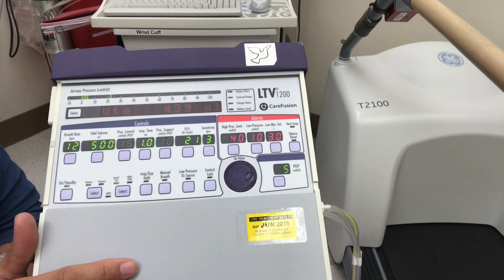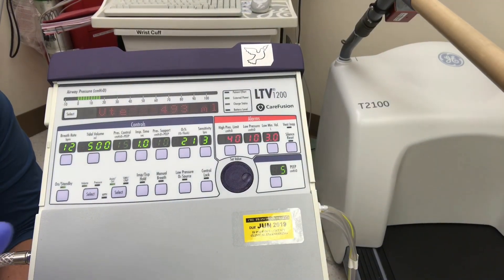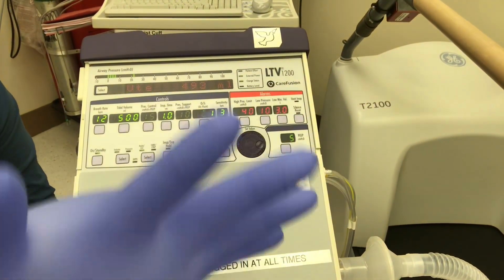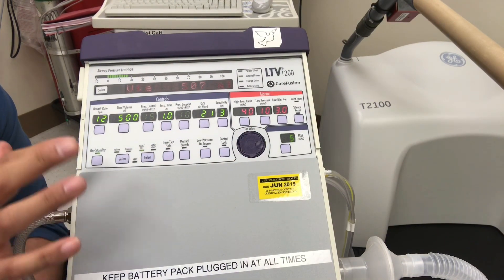Let's check tidal volume — this is a good way to detect a leak. We have 500 dialed in but we're returning 431 from this test lung, so we have some kind of a leak. I can hear it. It's not enough to trigger the alarm, but it reads and levels out right there.